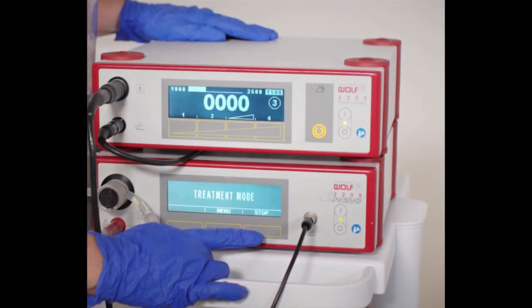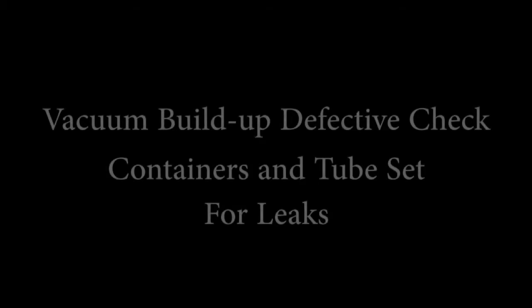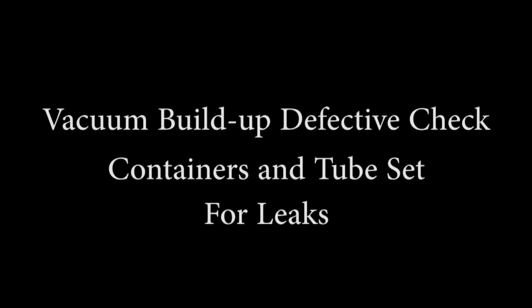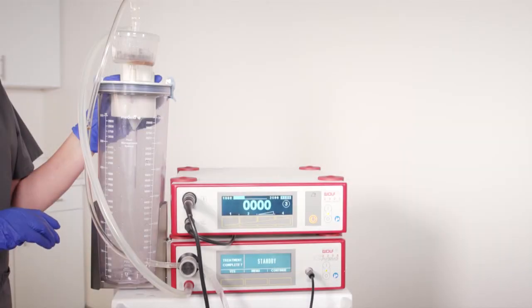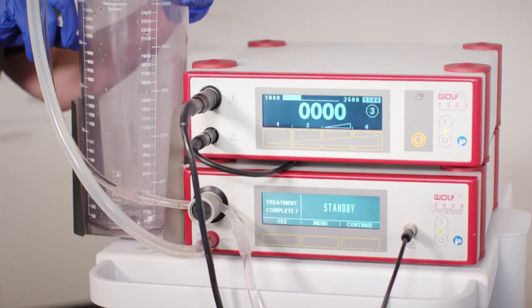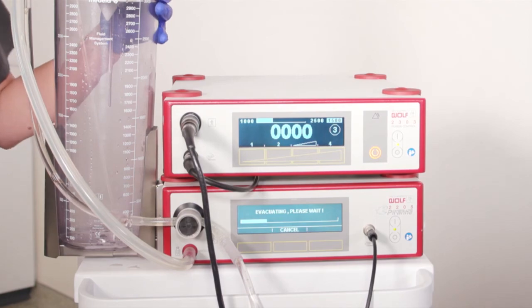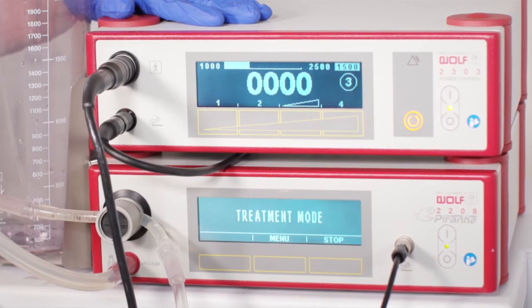Stop must be pressed prior to removing the lid from the canister. If the lid is removed prior to decompressing the canister, the unit will alarm indicating vacuum buildup defective. Once the secretion container is empty, replace and lock the lid and press continue. The surgeon must wait until the evacuation is complete and the screen indicates treatment mode to carry on.